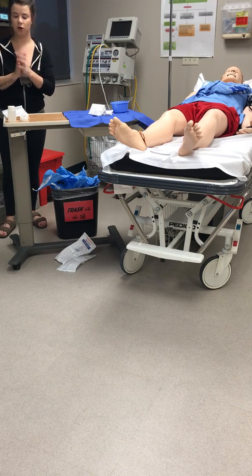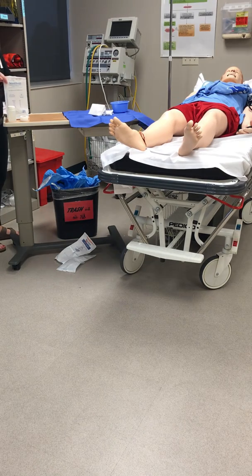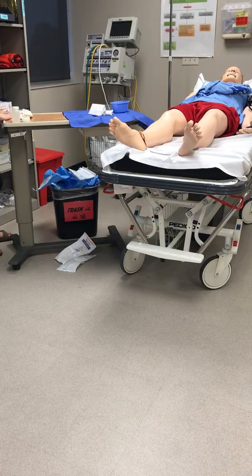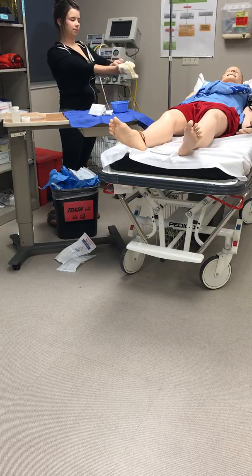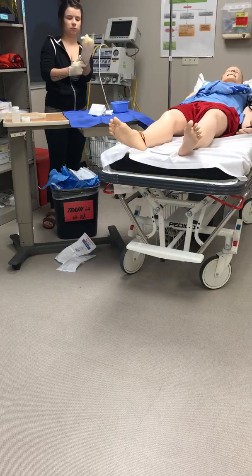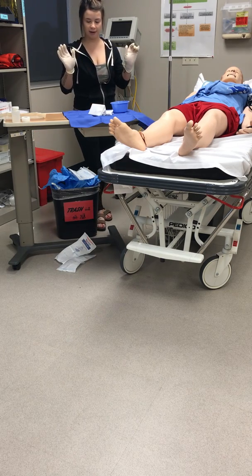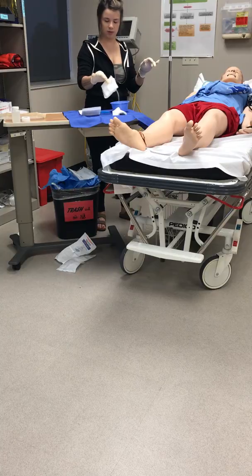Alright, and then I'm just going to go ahead and wash my hands with soap and water one more time before I put my gloves on, just to be sure that I'm nice and sterile. I'm going to get my gloves on here. Okay, so that is all good to go. Okay, so now that I have my sterile gloves on, I can kind of arrange this stuff a little bit. I'm going to go ahead and put these gauze in the bowl there.